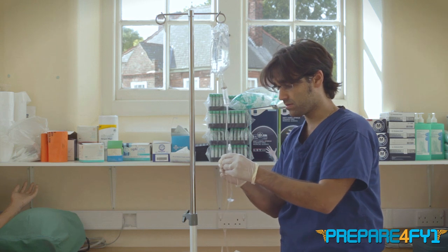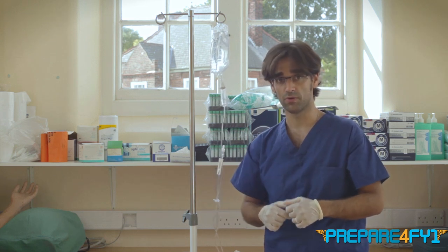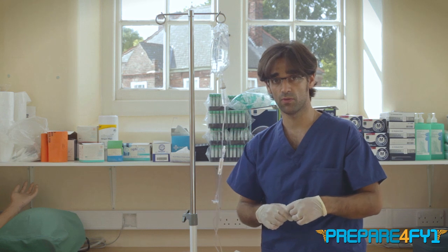You can then hang it up — and that is a slightly easier way of putting up a bag of fluids. It's a really important skill, especially in the acutely unwell patient.